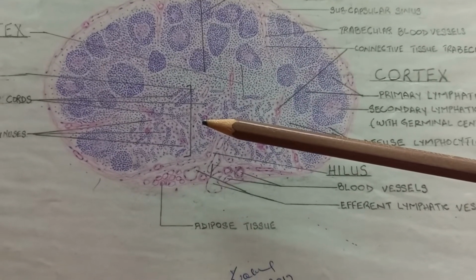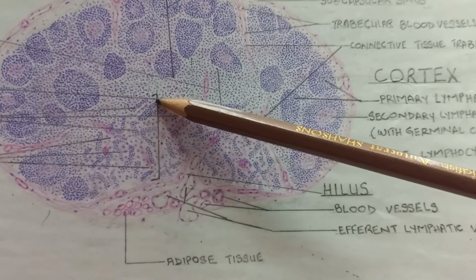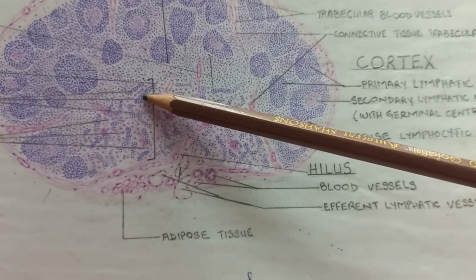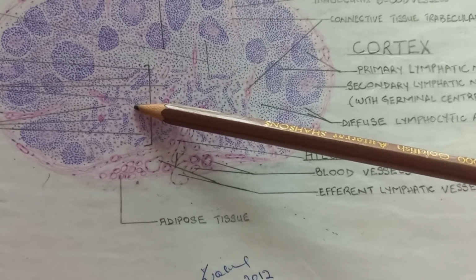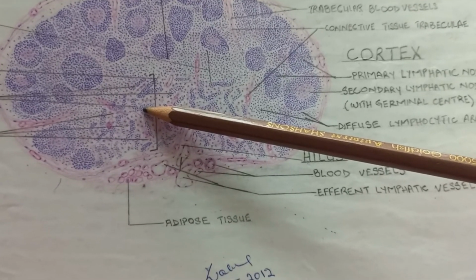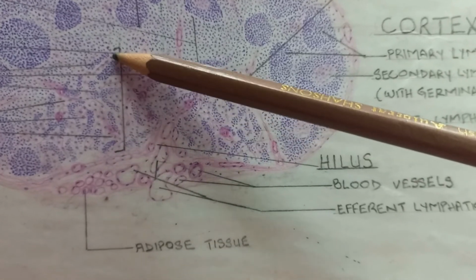Firstly, the medullary cords. What are these? These are irregular anastomosing cords. What is their composition? They have B lymphocytes and plasma cells, which reside in the reticular fibers and the reticular cells. Then we have the medullary sinuses. Medullary sinuses are the lymphatic sinuses which intervene between the medullary cords and the medullary trabeculae. You can appreciate these are the medullary sinuses between these medullary cords.